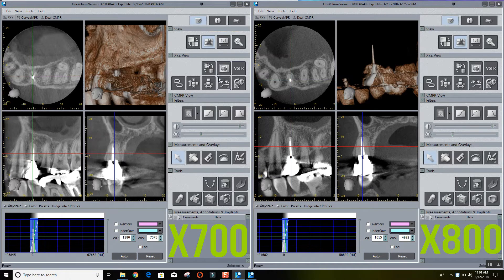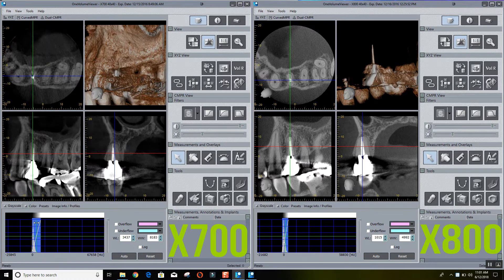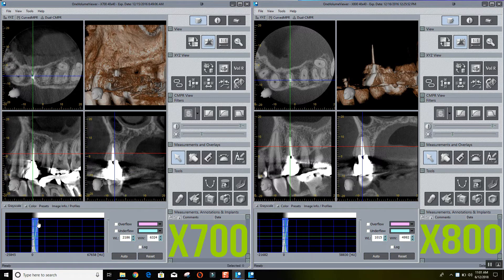Today we're going to be showing two scans of the same case, one taken on the Jaymerita X700 and the other taken on the new Jaymerita X800, to demonstrate the difference in image quality between the two machines, especially in the presence of restorations.